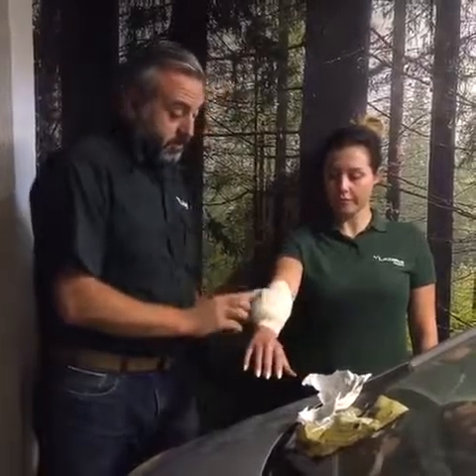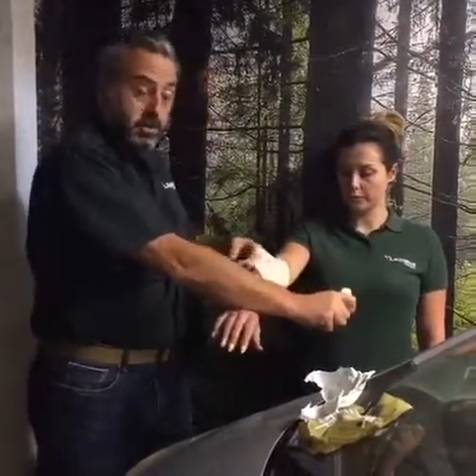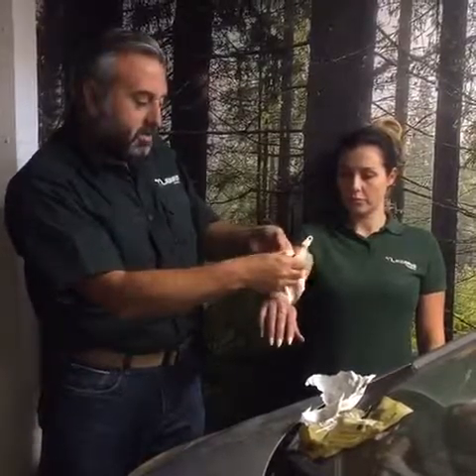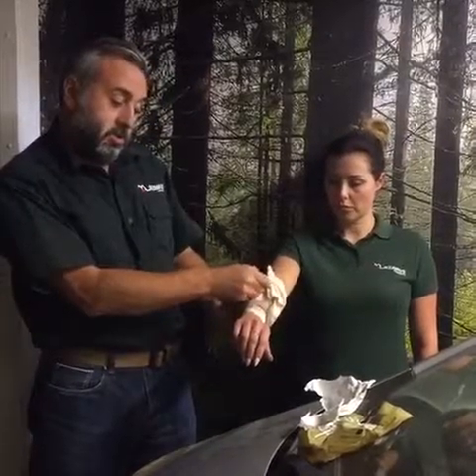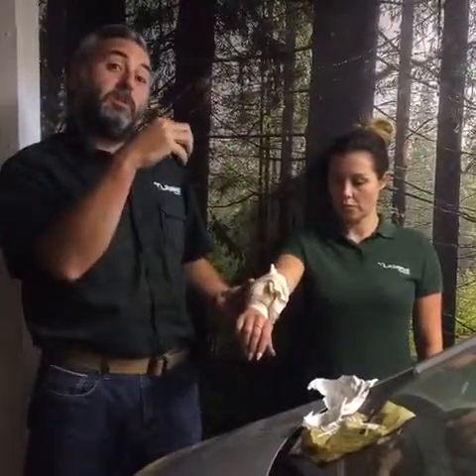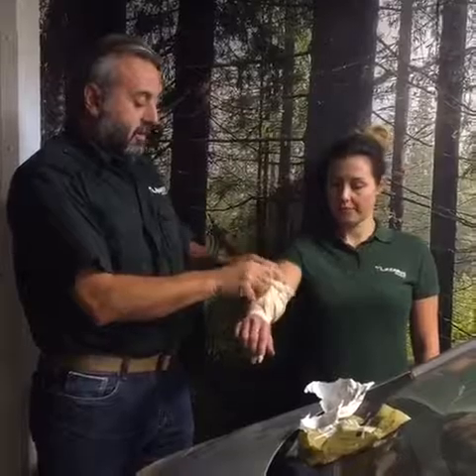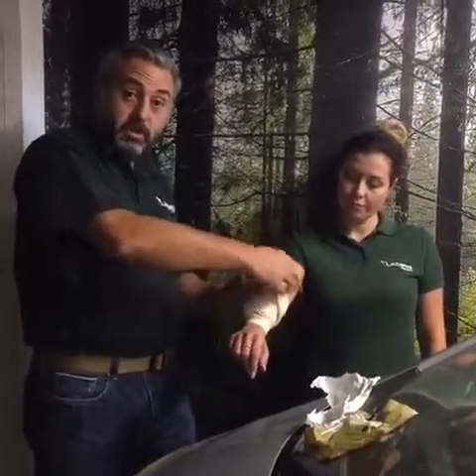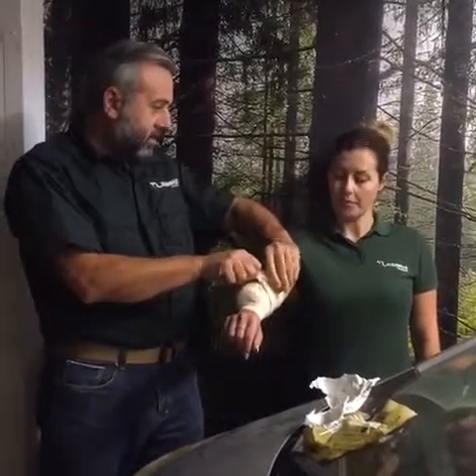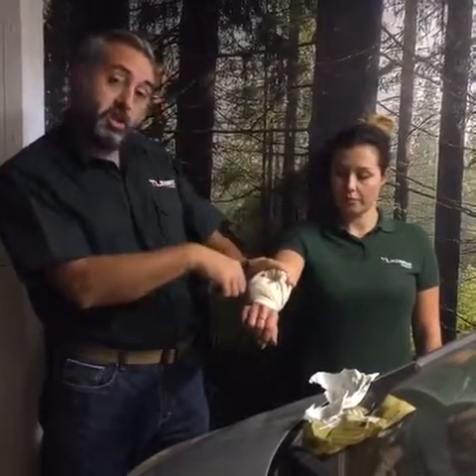There are a couple of little tricks built in. There's a clip on the end with little teeth built into it, so the idea is I can hook it on and secure it tightly. But it also gives another option: if the bleeding's pretty bad, I can take this bar bit, tuck it through underneath this loop over where the cup was — our aiming mark over the wound — and if I twist this now, it pulls tight around and becomes what we call a windlass, because we're applying it directly over the wound. You can then secure that in place and it puts lots of pressure down through the wound.